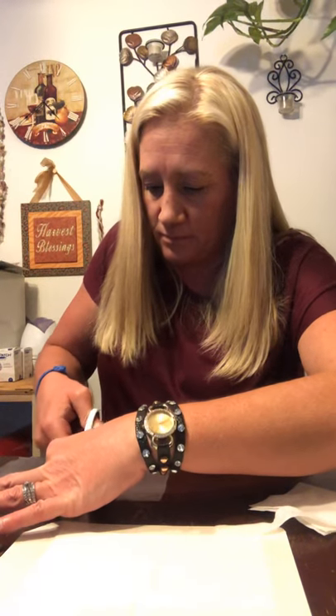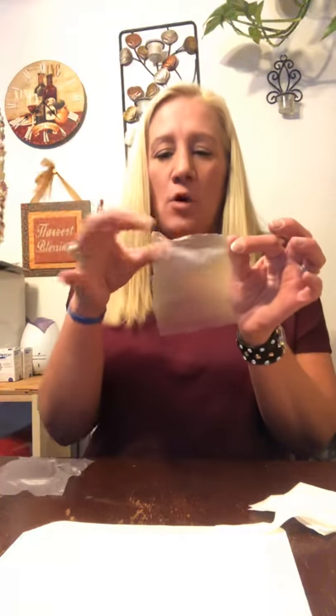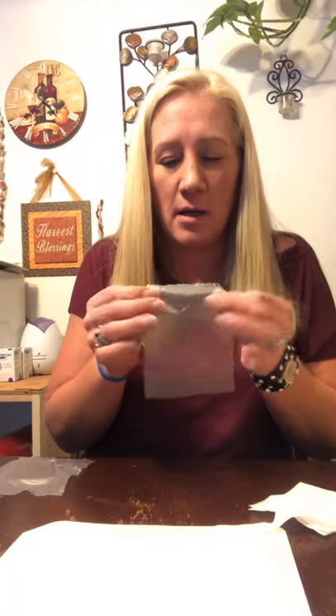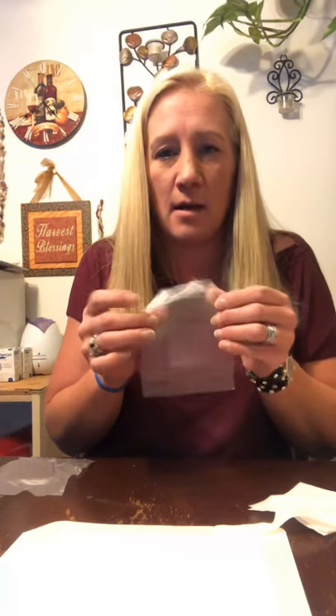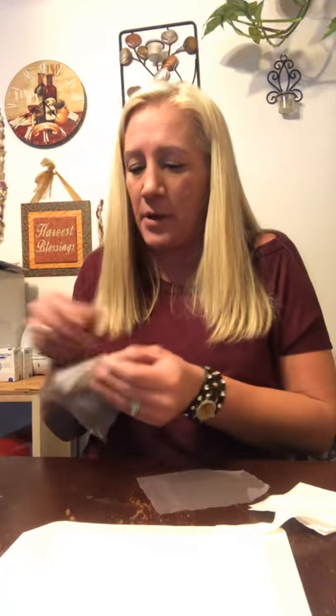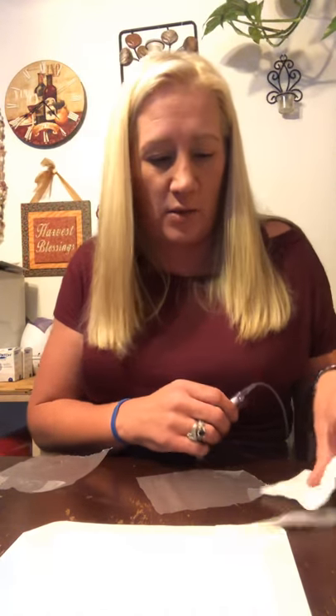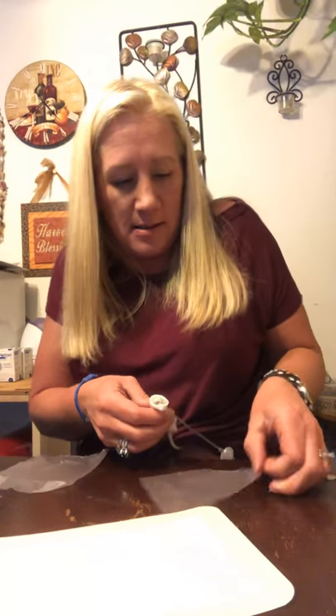Cut the pieces into little squares about this big. What I've found makes it easier to take off is to fold the corners of the sticky side like this. When you go to wrap it, that makes it easier to come off because sometimes it sticks more than you'd expect. It's better to be safe than sorry. Just wrap it up like that.